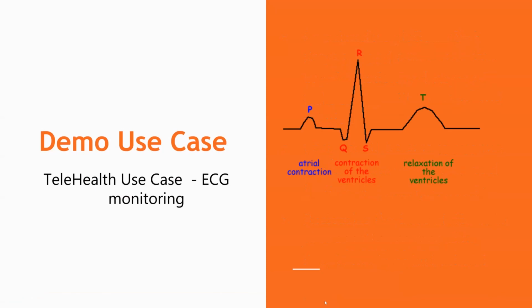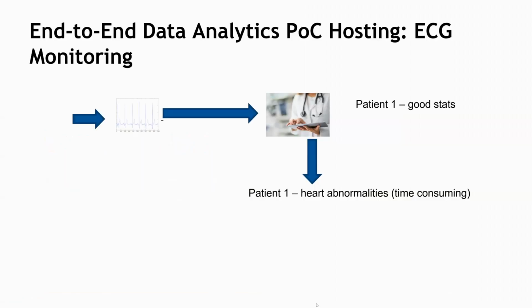Telehealth has become popular in recent years, so we will use that as our use case, in particular ECG monitoring. With the development of wearable tech and mobile phones, extending telehealth beyond Zoom calls to your doctor's office is already taking shape. Traditionally, we go into the doctor's office and get the ECG done. If you do not end up rescheduling your appointment, that is, it's not always good enough to help save lives.